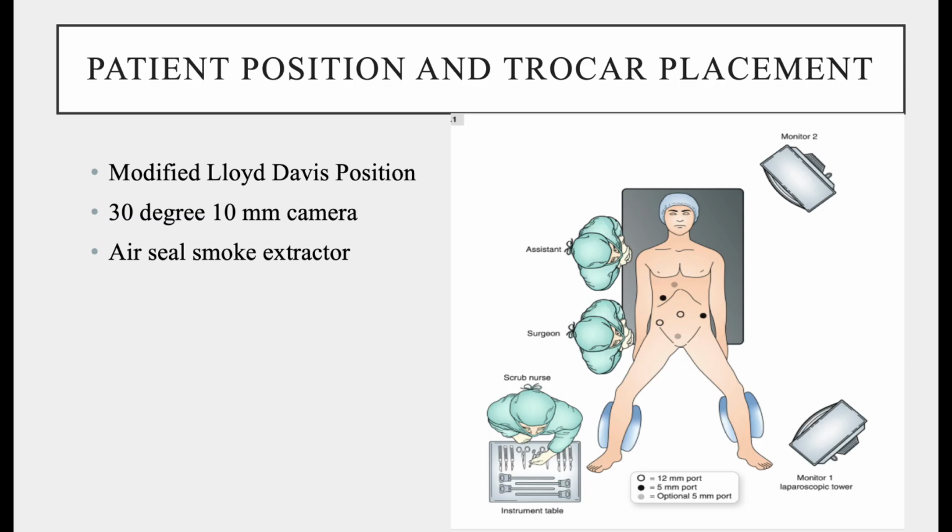Left colic artery. It was placed in modified Lloyd-Davis position. A 30-degree camera was used with two 12 mm ports at supraumbilical and right lower quadrant, along with three 5 mm ports at right upper quadrant, epigastric and left lumbar sites.